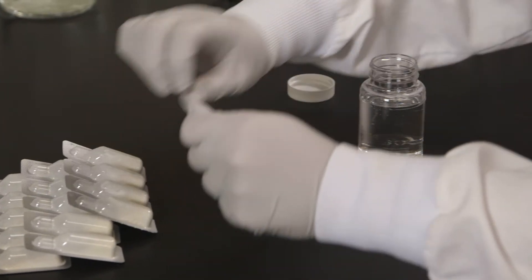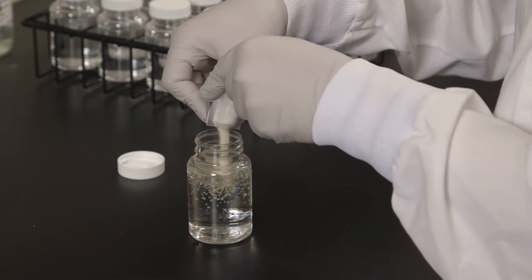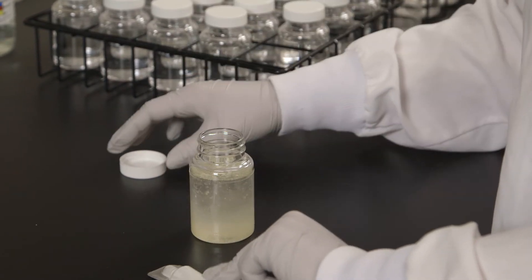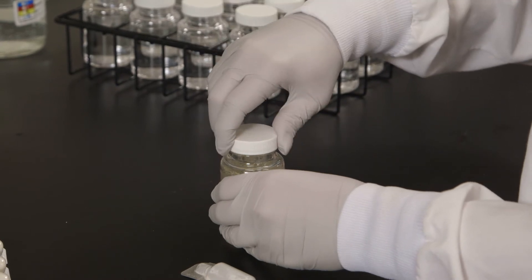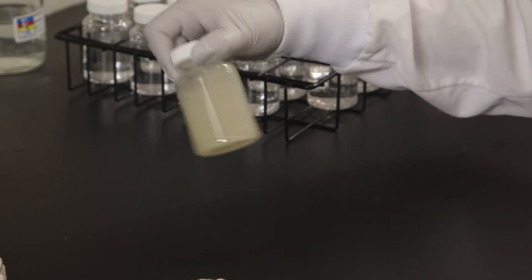Snap open the reagent pack and pour the powder into the 100 ml water sample. Cap the vessel and shake until the contents are dissolved. The sample may remain cloudy.